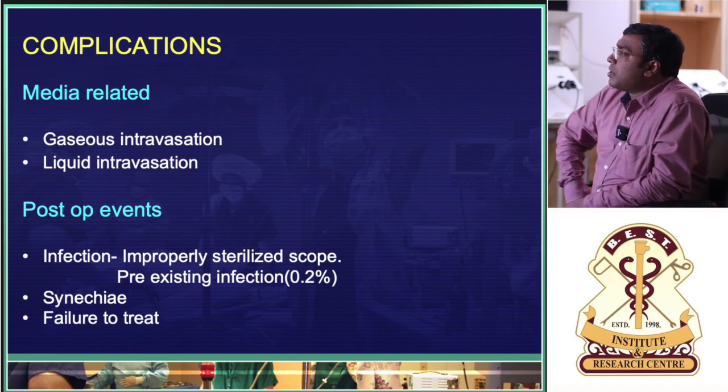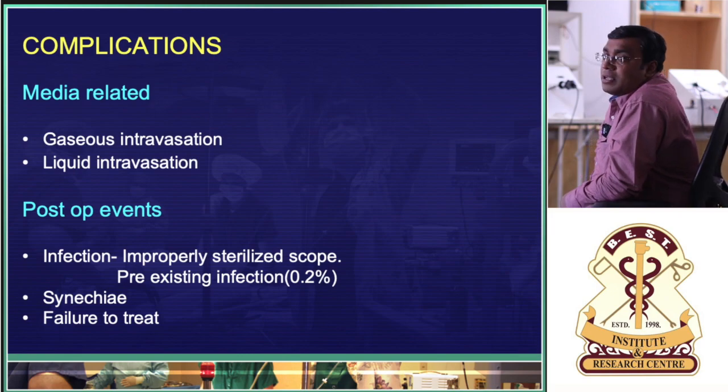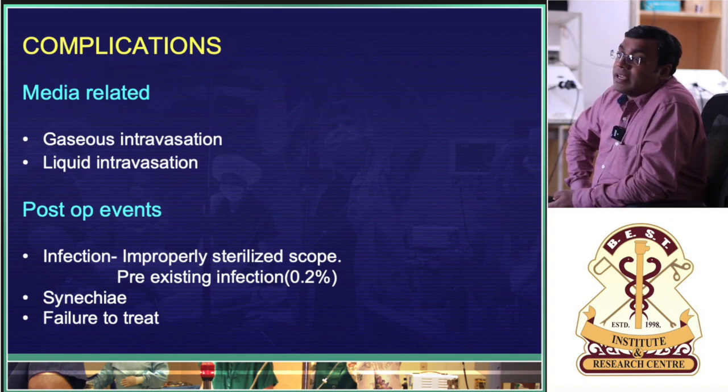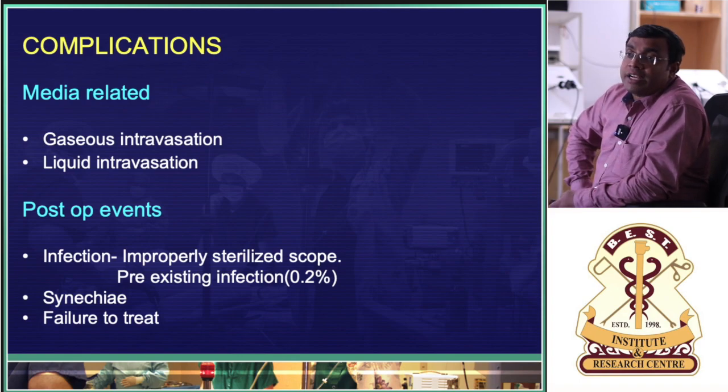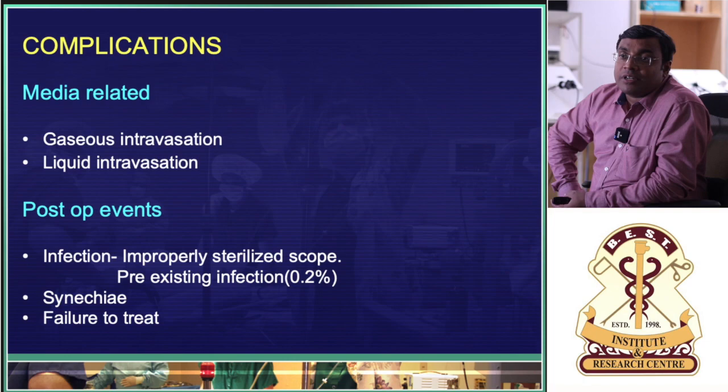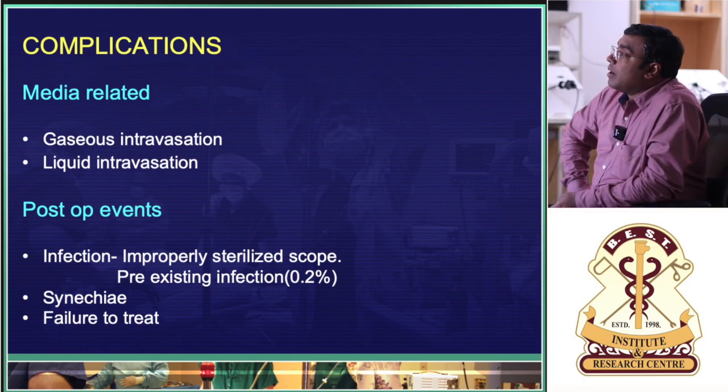When it comes to post-op, infection can happen if you don't maintain proper asepsis. Inadvertent use of the hysteroscope and curette and other things can cause synechiae, and failure to treat when you have perforated the uterus or the cervix right before you complete the procedure.